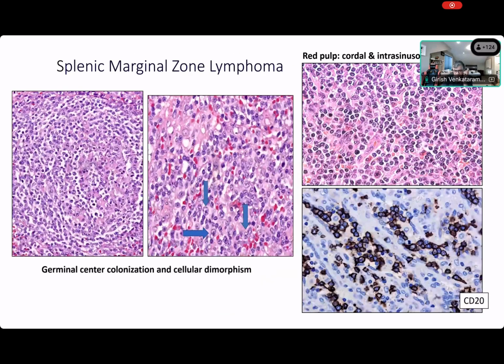This is actually a lymph node on the left side that I'm showing, where marginal zone lymphoma occurs in the paracortex, right? In the lymph node. Typically, it occurs in the marginal zone and it expands and goes to the paracortex. And it fills the paracortical regions with B cells. So that's how you know that the lymph node is abnormal. If there are too many paracortical B cells, usually the first inference is a marginal zone lymphoma. And if reactive follicles are seen, you blame marginal zone lymphoma as a possibility. Sometimes marginal zone lymphoma can grow inward into the follicle itself and colonize the follicles.